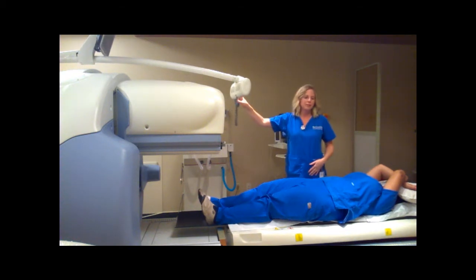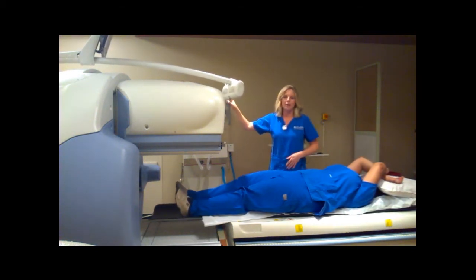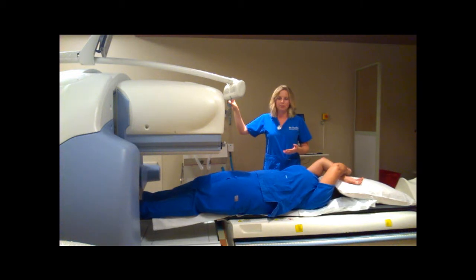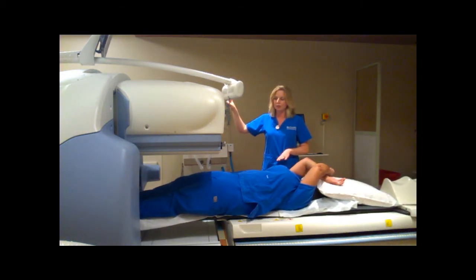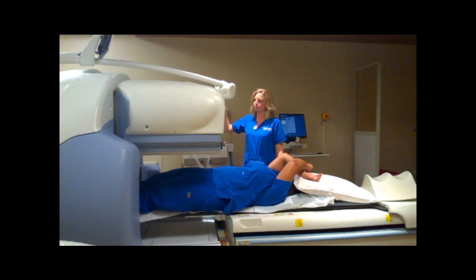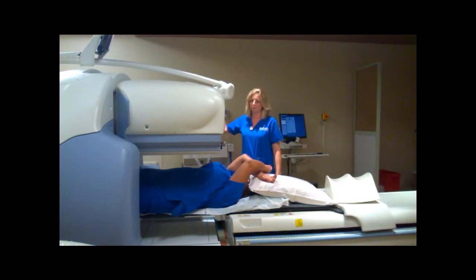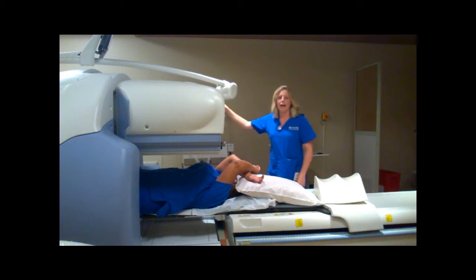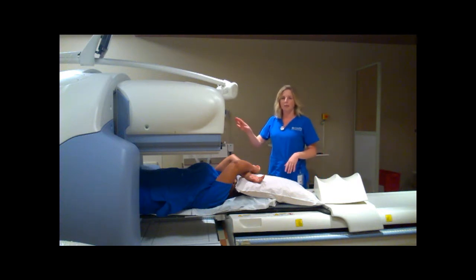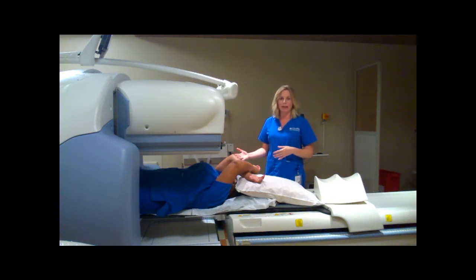The next thing I'm going to do is get my patient in position. Normally here I would look at the P-scope to get the anatomy that I want — if I want to look at the liver or the spleen, for example. Tracy doesn't have any radioactivity in her so we can't actually do that, so I'm just going to pretend here. Once I'm ready and in position, I would start the acquisition on my computer over here. This camera begins with the SPECT first, and then the CT portion comes after it at the very end.